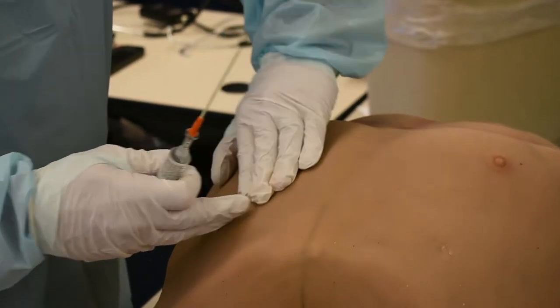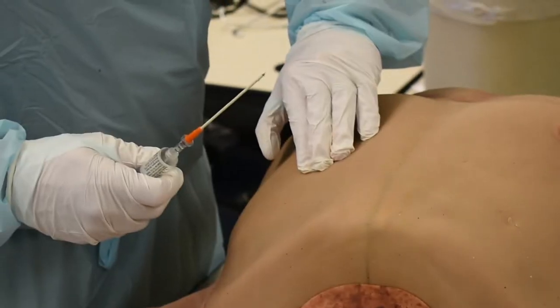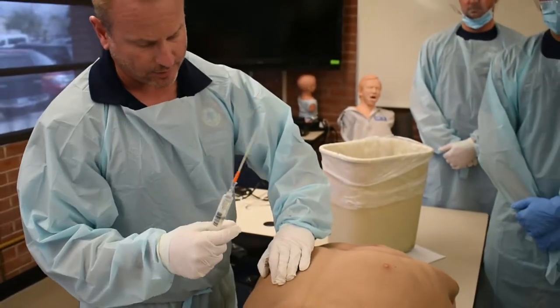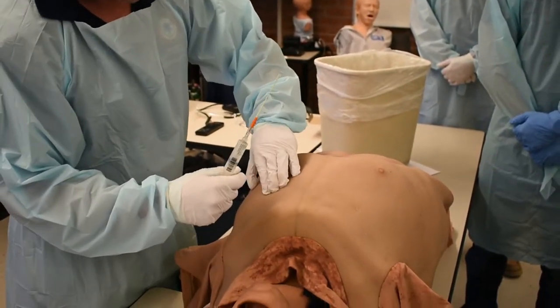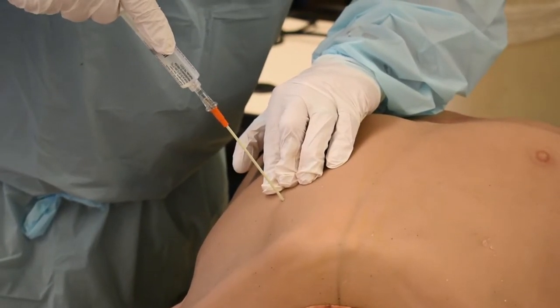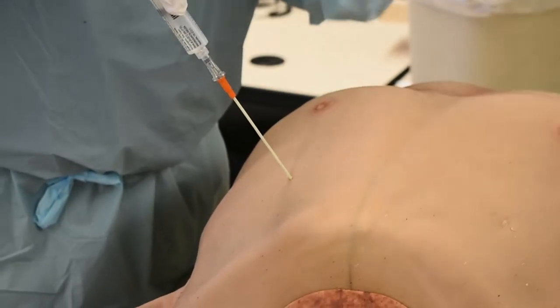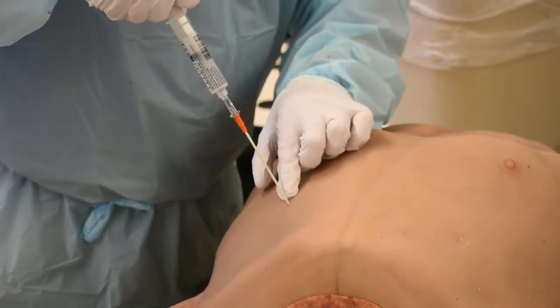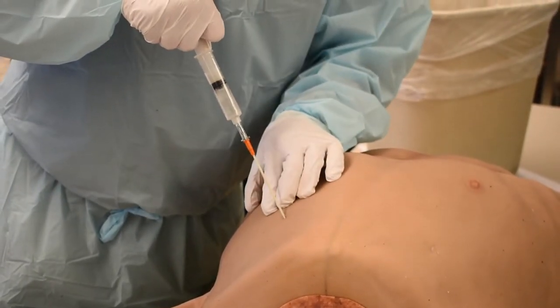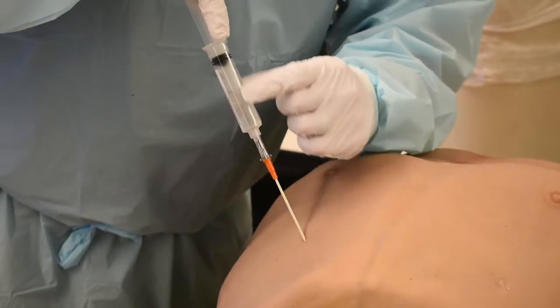I've cleaned the area and found my rib. Sometimes you have to be pretty aggressive and push pretty deep to find their rib. I pull that skin down and make it nice and tight. With my right hand — my driver hand, the hand I do everything with — I pull down and put my needle directly on top. Even if you slightly hit the rib, as soon as I let go of the skin, the needle is always going to want to go up, so you'll be right on top of that rib every time. As I bury my bevel, I start pulling back. As I drive that needle through the chest, I get this huge rush of air — it may be blood-tinged air, and that's okay.